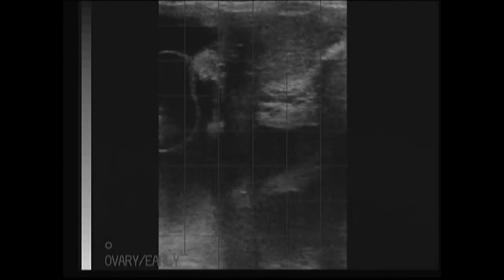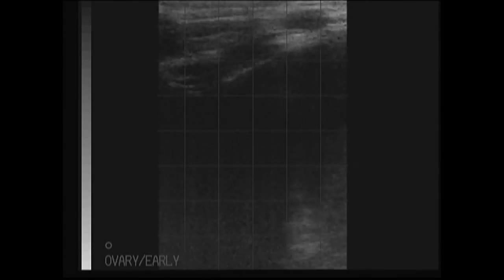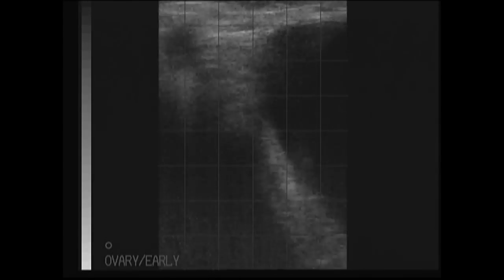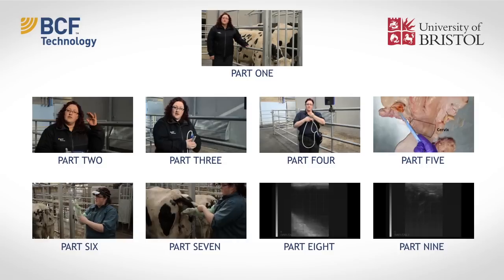We get one last glimpse of the corpus luteum as we come out.